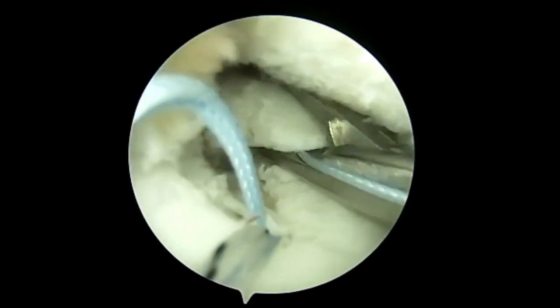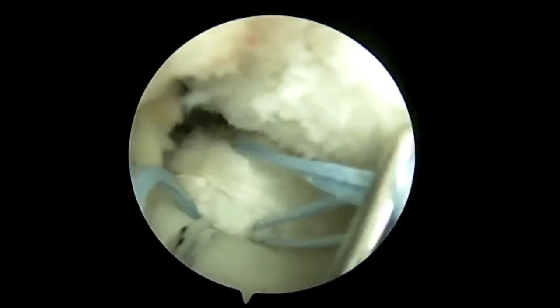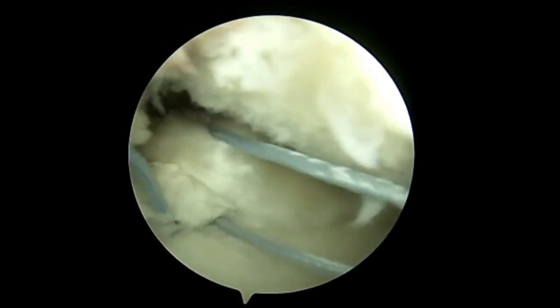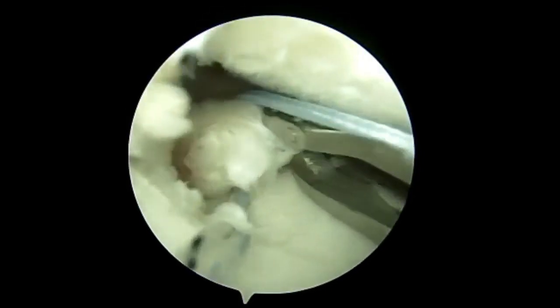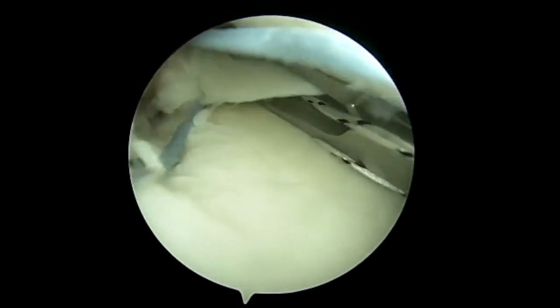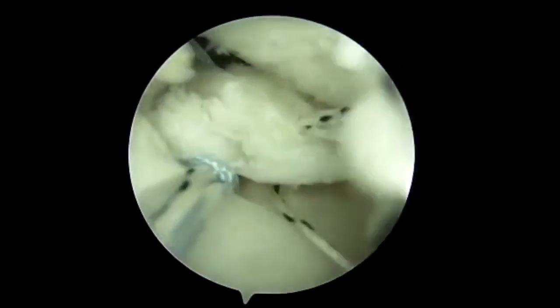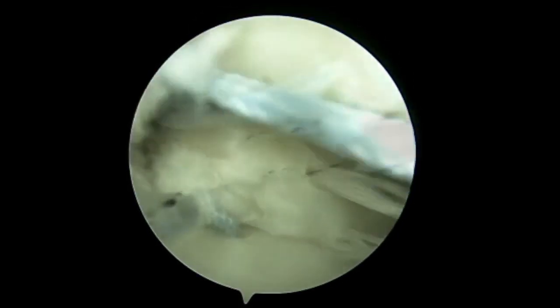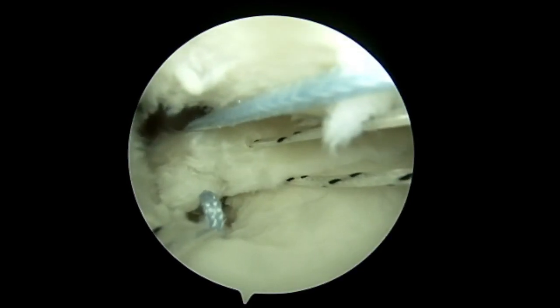The solid blue suture is now retrieved using a suture grasper, and a suture passer is used to pass it through the meniscus without significantly tensioning the suture. The blue suture is shuttled from superior to inferior utilizing a loose tiger link suture through the meniscus to achieve this horizontal mattress configuration.